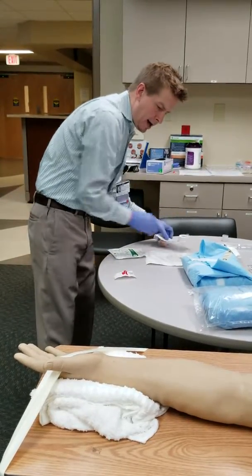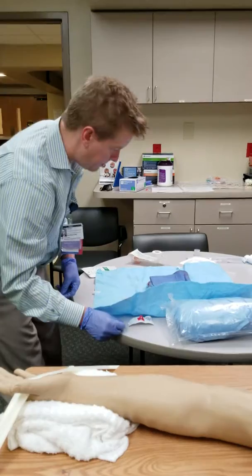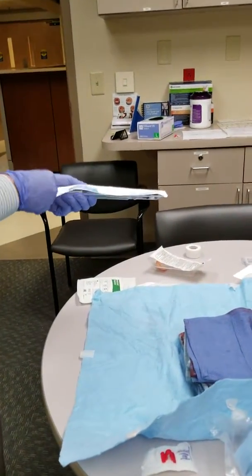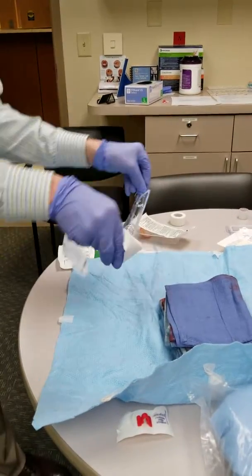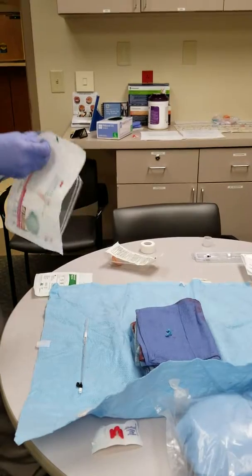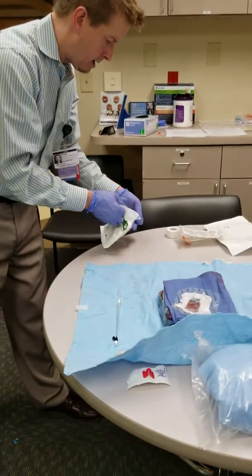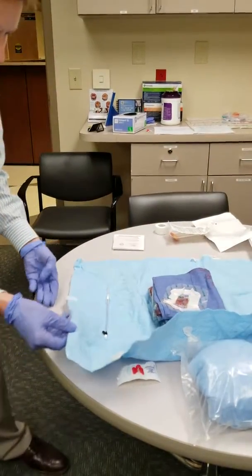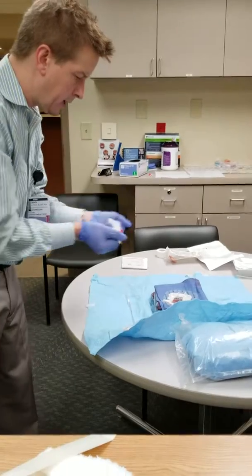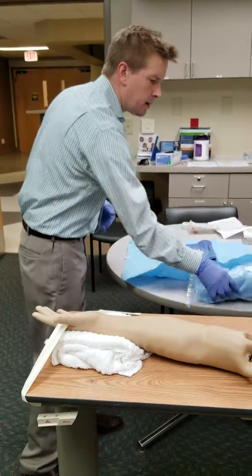Let's go ahead and start opening our sterile towels, because this will create an area for me to drop things into. I'm going to go ahead and pretend I'm opening this Arrow and drop it in away from you. Open the boat for my 4x4s. Sterile gloves — we're going to just come from the side. And then the securement device; some facilities will suture in, we use a StatLock. Now the arm is fixed, clean, and all of my things are here.